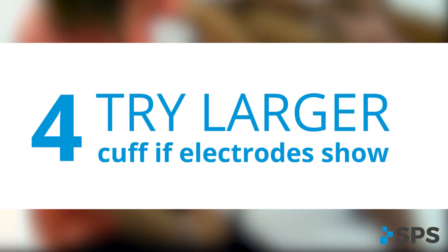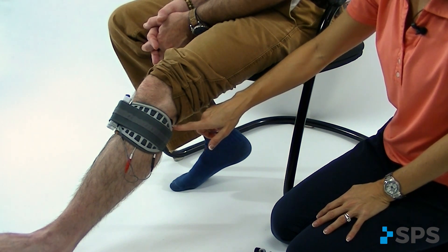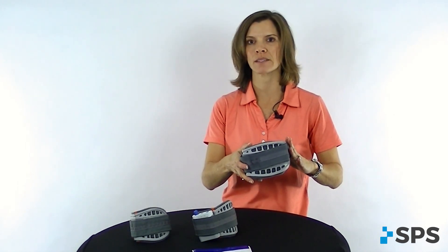Another issue that we sometimes run across is that the patient's electrode is not captured by the cuff. It's really important that we maintain contact of that electrode with the skin at all times. So if this happens, replace it with a large cuff. That way you'll have complete electrode coverage and contact with the skin at all times, and you'll have more reproducible outcomes.